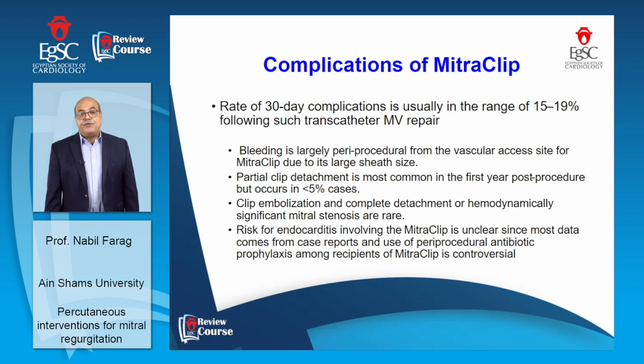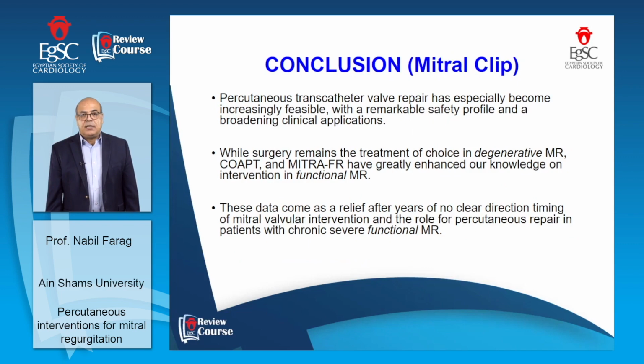The rate of other 30-day complications is usually in the range of 15 to 19% following such transcatheter mitral valve repair. Bleeding, partial clip detachment, clip embolization, and endocarditis are all considered complications that happen within 30 days after this repair. The conclusion as regards the MitraClip is that percutaneous transcatheter valve repair has become increasingly feasible. As we said, with the learning curve, the number of patients using this technique is increasing, with a remarkable safety profile and broadening clinical applications.